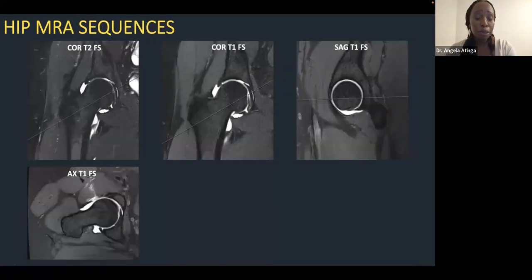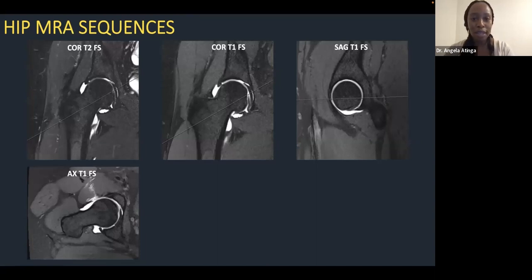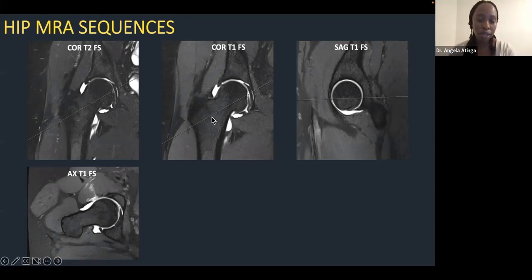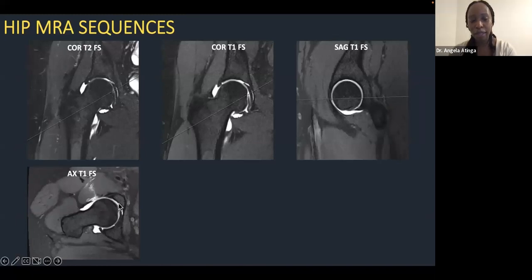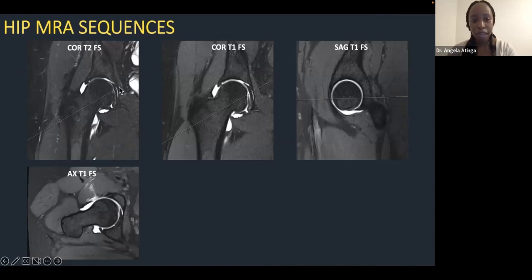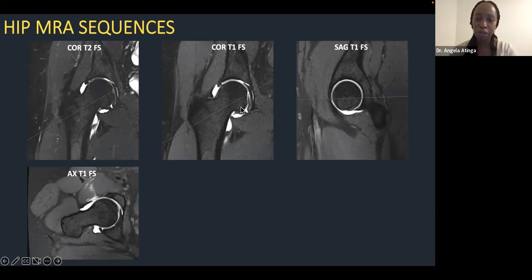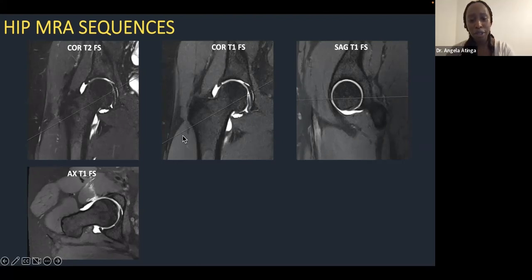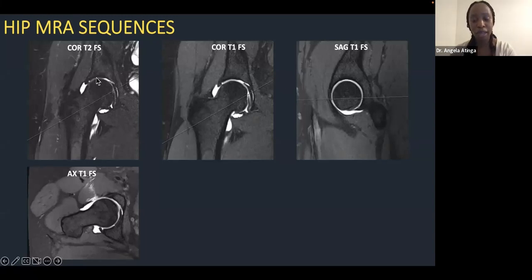For MR arthrograms, remember gadolinium is T1 bright. Once gadolinium is instilled into the hip, most imaging is done as a T1 fat-sat sequence — coronal, sagittal, or axial oblique. We also acquire a T2 fat-sat image of the hip of interest, because on T1 fat-saturated images you won't appreciate any bone marrow edema or changes in the surrounding musculature. You need a true fluid-sensitive sequence that doesn't rely on gadolinium.